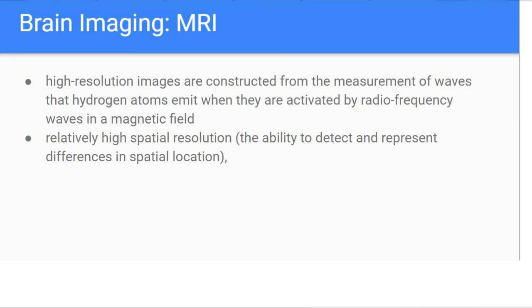By utilizing it, we come to know what kind of change is there, whether there is some kind of unhealthy change in any particular part of the brain, whether there is some kind of inflammation, whether there is some kind of structural change, some kind of configurational change happening there. So that we come to know through MRI.